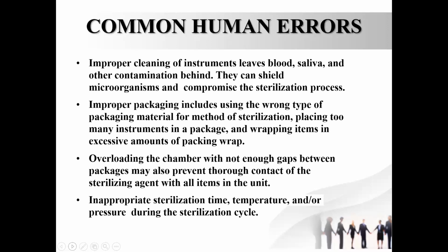I'm just giving you, from my experience, some common human errors. Okay, one is if the instruments are not cleaned properly, they look clean, but they have invisible dirt which shields and protects the microorganisms. It will not get sterilized in the sterilizer. Okay, if it is not cleaned very, very thoroughly.